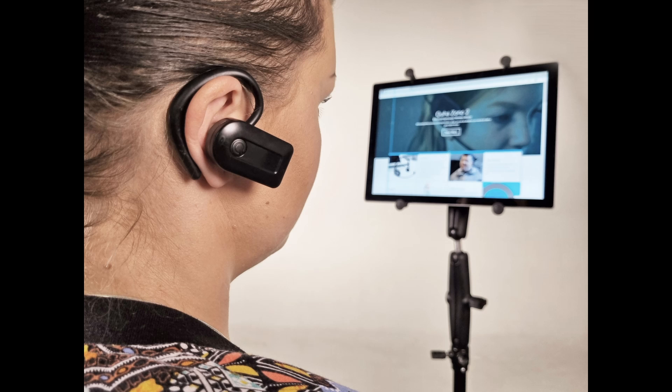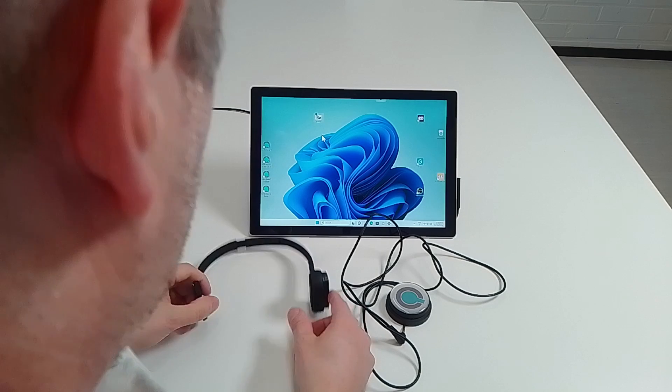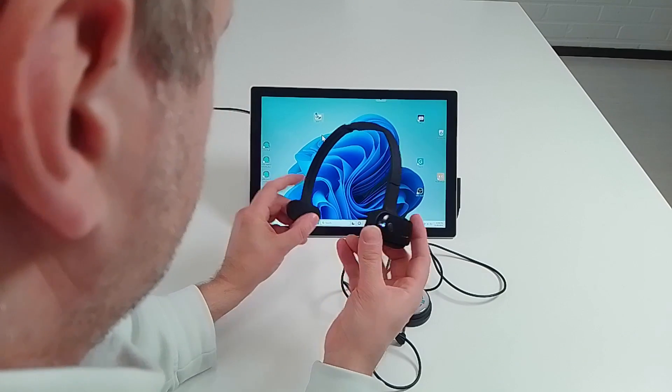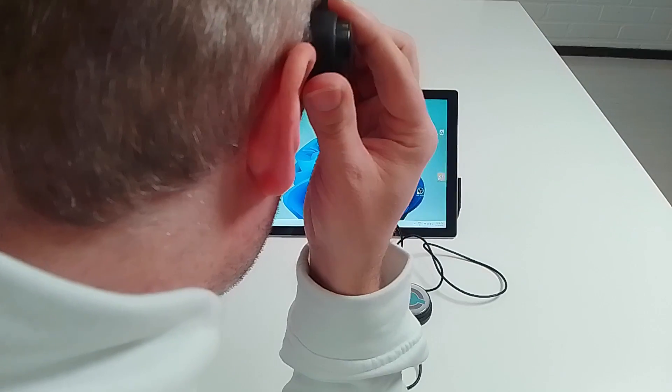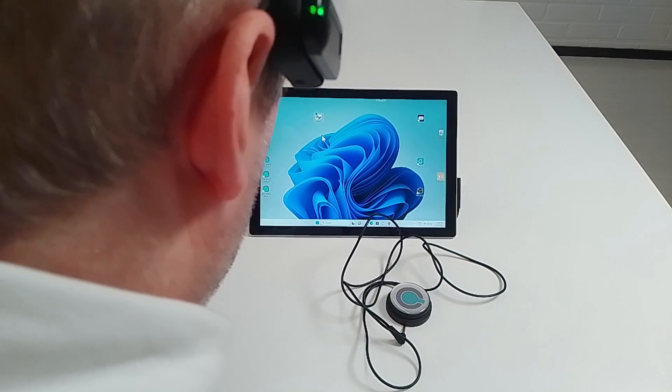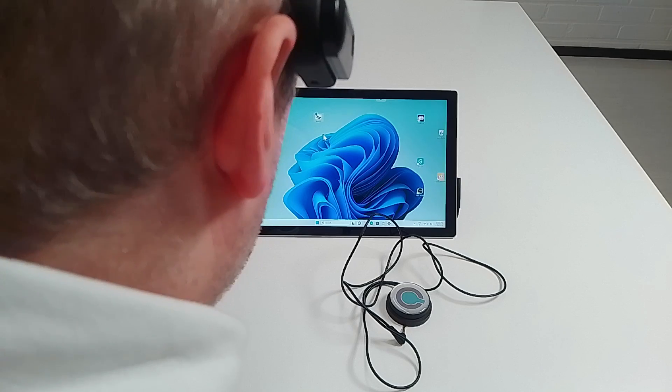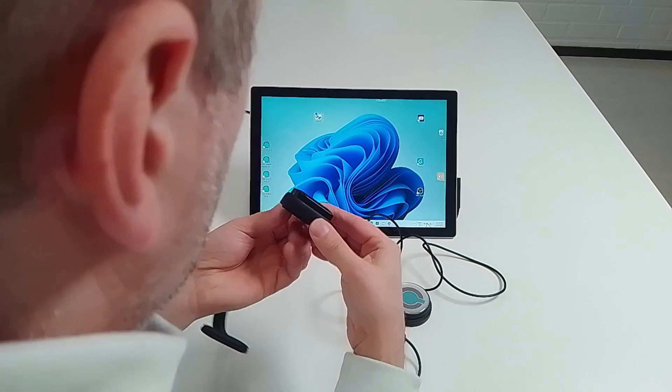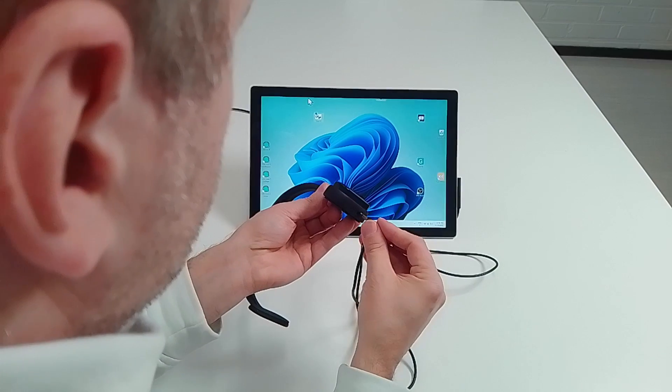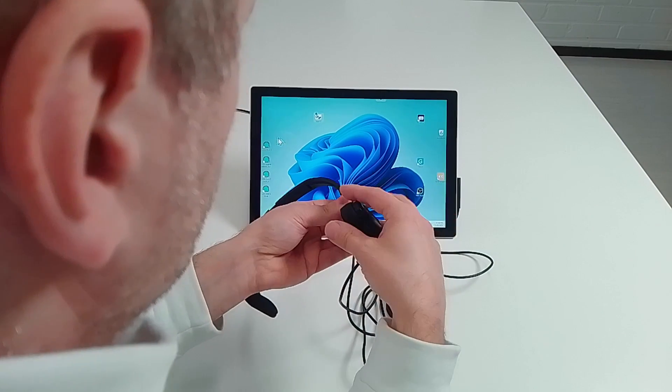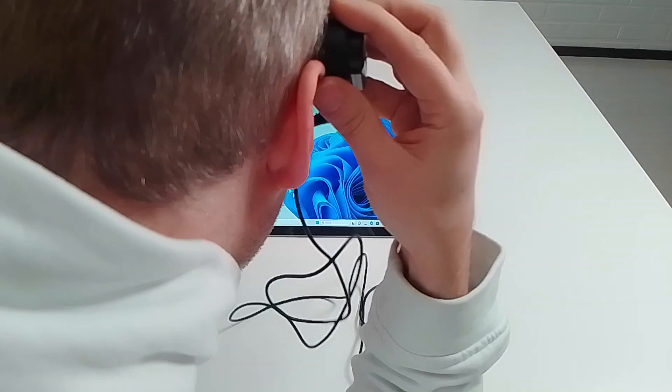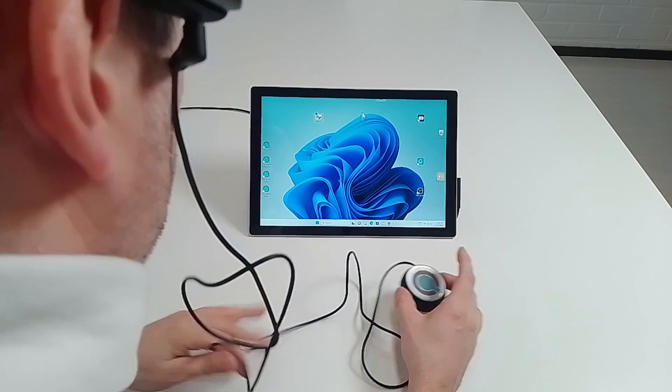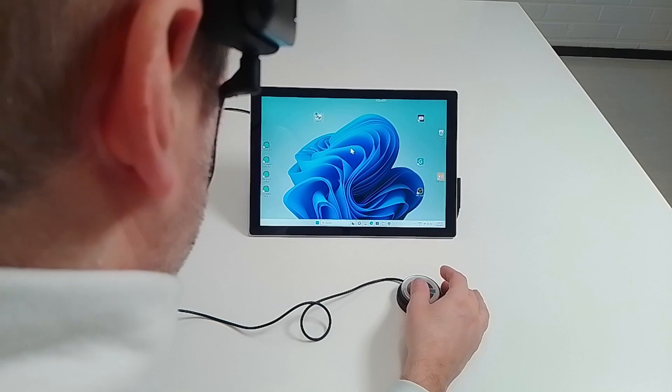Eight ways to click with KUHA ZONO-X. Click with an external button connected to headband. Turn on ZONO-X. Attach ZONO-X to headband. Plug in an external button with a 3.5mm connector. Press the button to click.